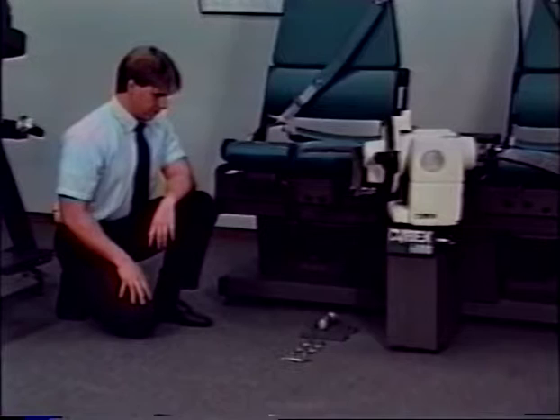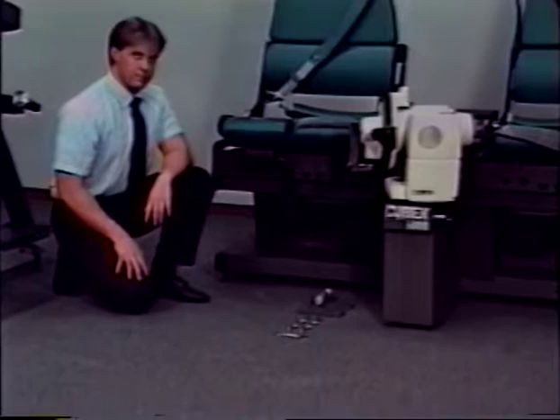The following will illustrate the one-time installation procedure necessary to adapt the Cybex 6000 to accept the TEF modular component.